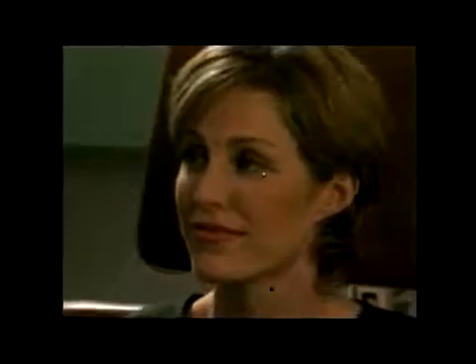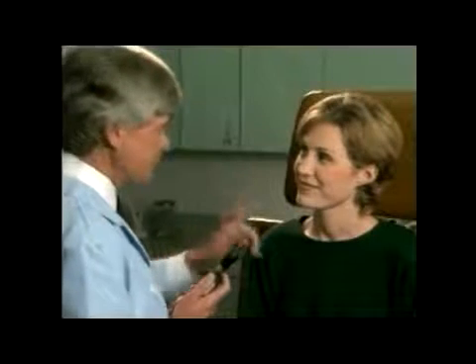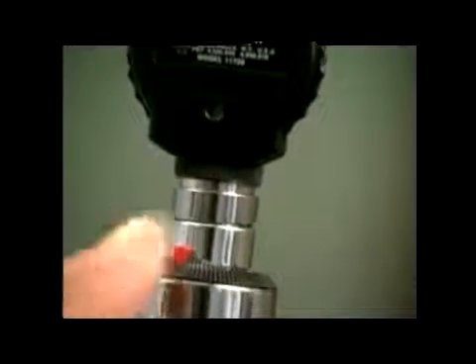First, you may want to dim the room lights in order to conduct a successful examination of the fundus. To examine the right eye, sit or stand at the patient's right side. Turn the ophthalmoscope on and rotate the rheostat to the desired light output.